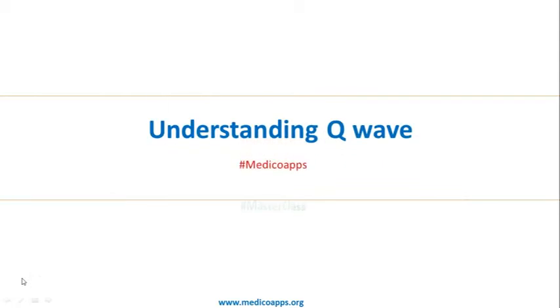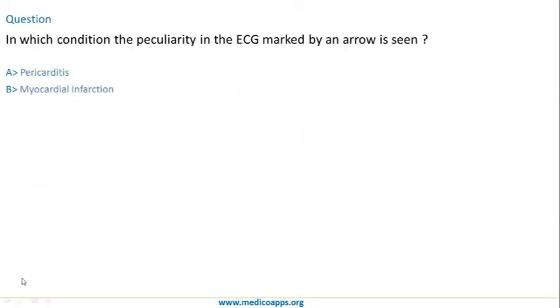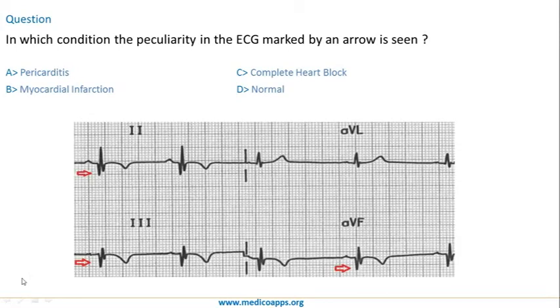A Q wave is any negative deflection preceding the R wave. Let's first look at a question asked about Q waves in the NEET PG exam: in which condition is the peculiarity marked by the arrow seen? The arrow marks a deep Q wave in inferior leads 2, 3, and AVF.